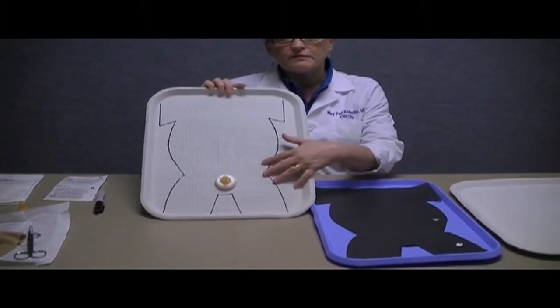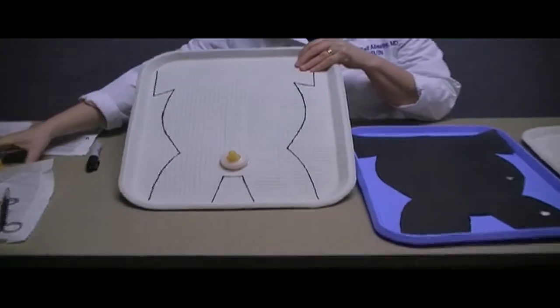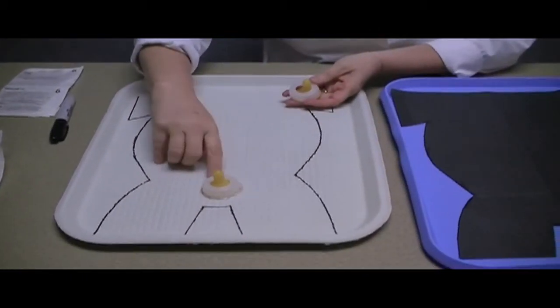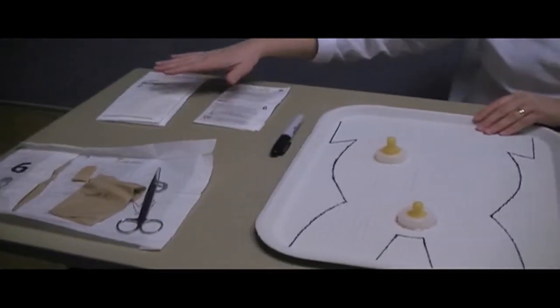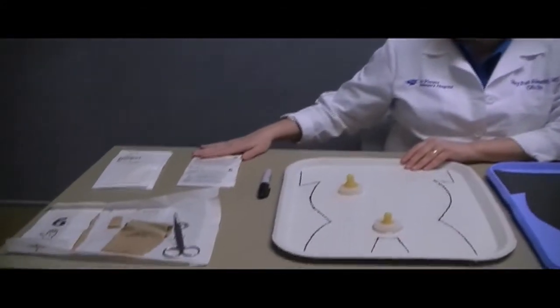And then once you have that, you want to get a hot glue gun and glue both an infant bottle nipple as well as the lid onto your tray such that it will stay permanently. Other things that we use for this low fidelity model are to gather any gloves that are left over. These are surgical gloves, usually size 5.5 or 6 work best.